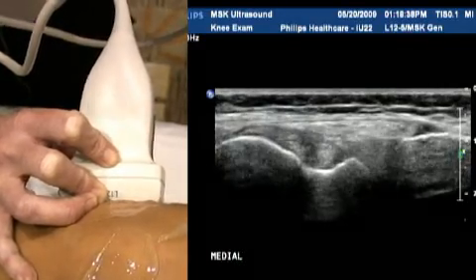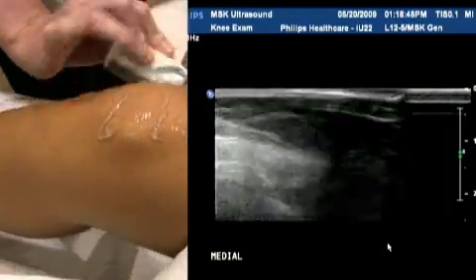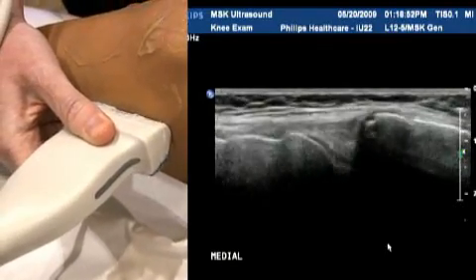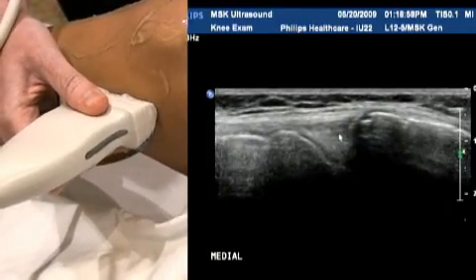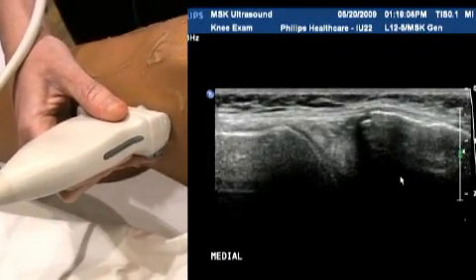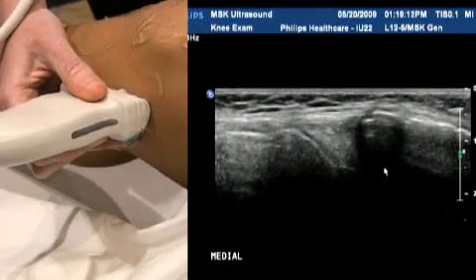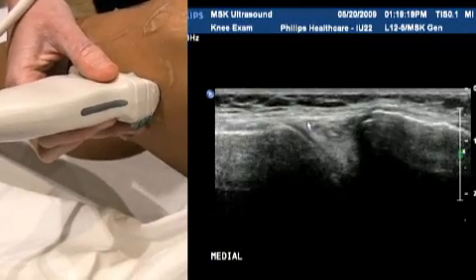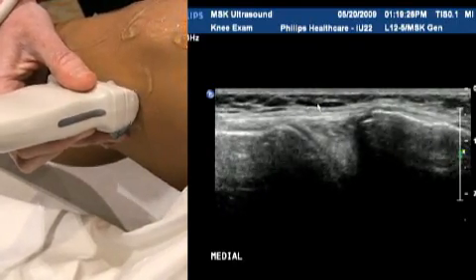On we go medially. Again it looks similar to the lateral side. The medial meniscus can appear a little wider top to bottom — that's normal, not a sign of joint widening, just normal anatomical structure. The medial meniscus is quite echogenic. You're looking for continuity and any sort of fissuring going down through here. Or bulging is another finding — sometimes the meniscus will come right up and above the bony structures of the knee, abutting the subcutaneous fascia, and that's considered abnormal.